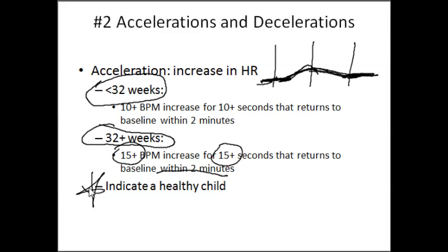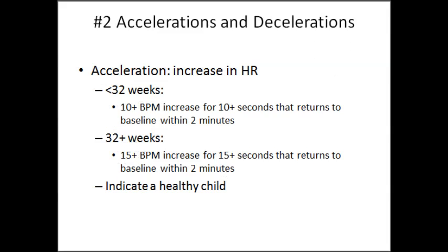This is indicative of a healthy child. These fetal heart rate accelerations are normal. It means the acid-base status of your child is going to be normal. You're confident that the acid-base status will be more normal. Okay, so that's accelerations.